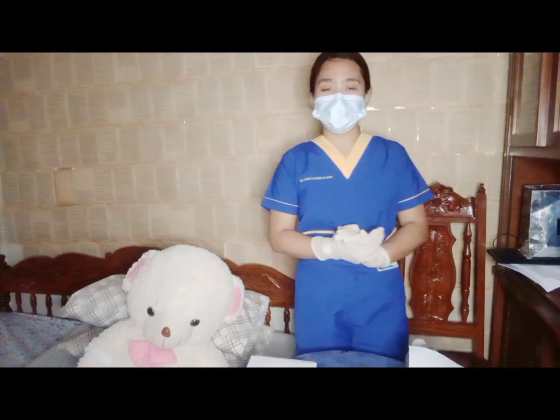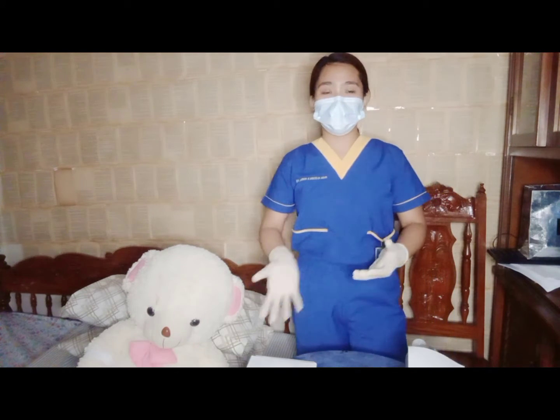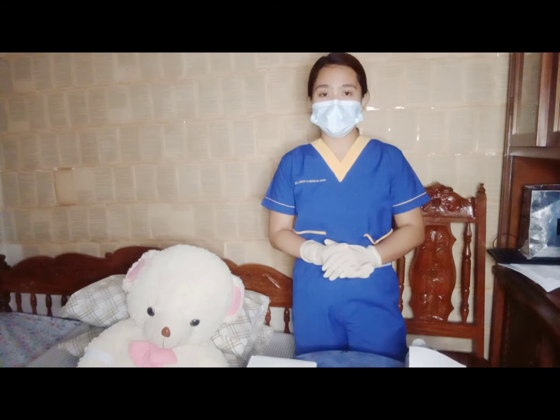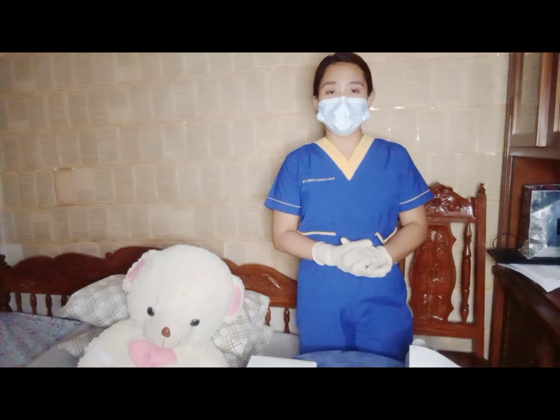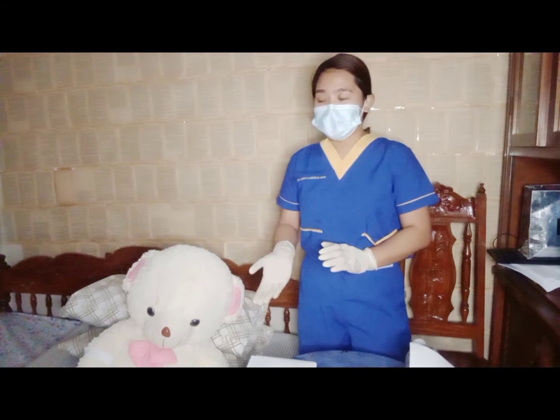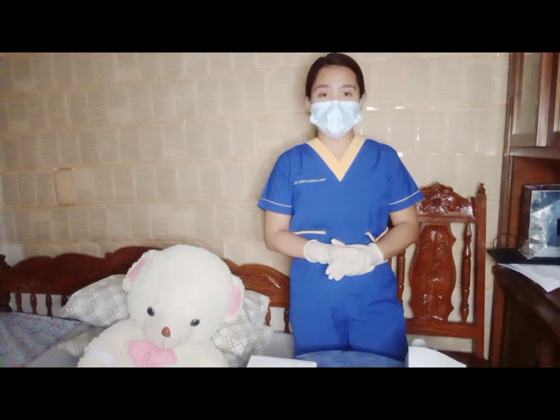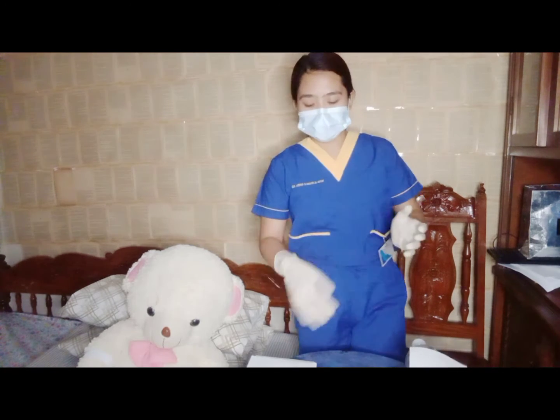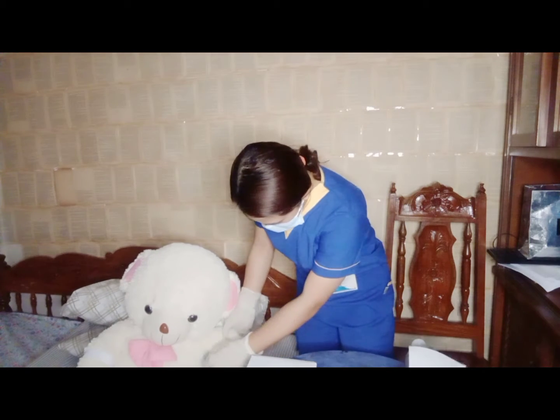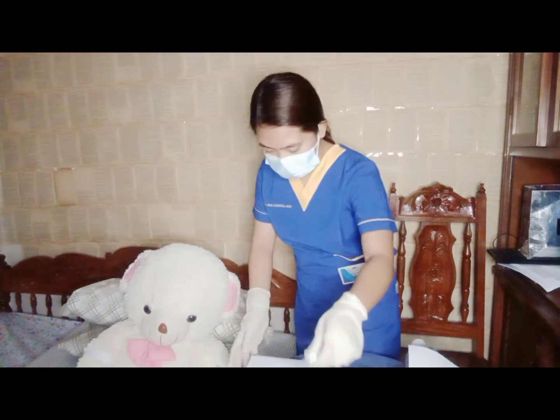Okay. So, before the blood transfusion, we need to check the vital signs of the patient, especially the temperature, which indicates the presence of hemolysis. Okay, so the importance of checking the vital signs, of course, is that if any changes in the vital signs are shown during the procedure or the transfusion, this may indicate an adverse reaction. So, let's check. Ma'am, check ko lang po yung temperature niyo. Okay.